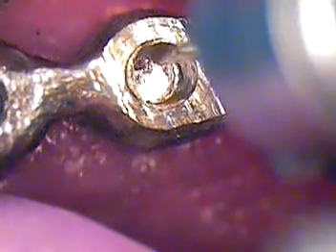Okay, we got movement, so that's good news. All right, see the lip? That's coming away. Or it could be the top of the screw coming away, we'll see. Well, it's a hex, right? Okay, I'm just going to put a dot there, see if it did get movement. Yeah, there it goes. See it spinning? Yep. Perfect. Okay, so this way is unscrew. Now, I just moved from here to here, but it's moving.